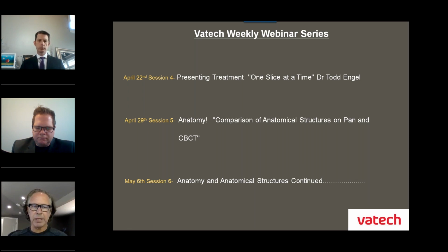So if you're looking at this technology and considering being involved in it, I want to encourage you, as opposed to thinking, wow, Jim just went over some great stuff, Paul just went over great stuff, Dr. Engel had some great stuff, oh my gosh, this is overwhelming. It can be, and I realize that. And so as a clinician, I just want to make this suggestion to you.